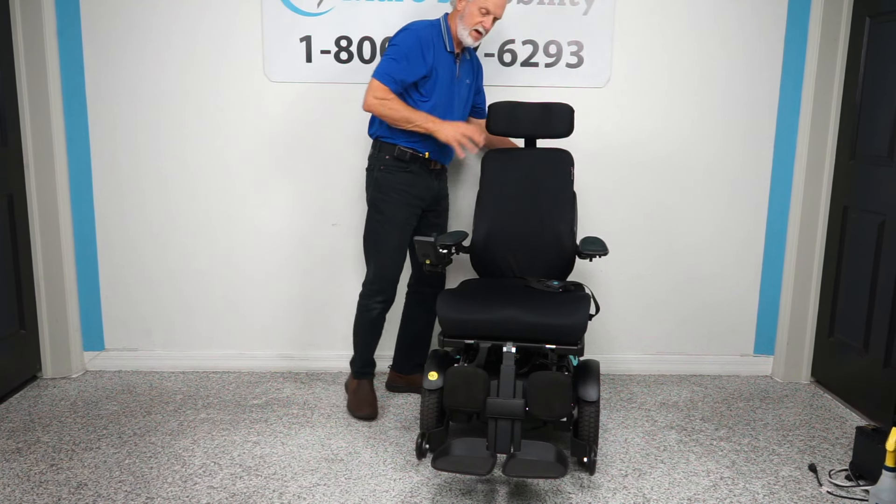You can see all the adjustments here to position the headrest. You have bag hooks right here, so if you want to carry a bag or groceries. We also have a Permobil backpack that can go on the back — it's a hard pack with a zipper. Give us a call if you want one. You can carry your charger, your purse, whatever you need on the back of the chair.